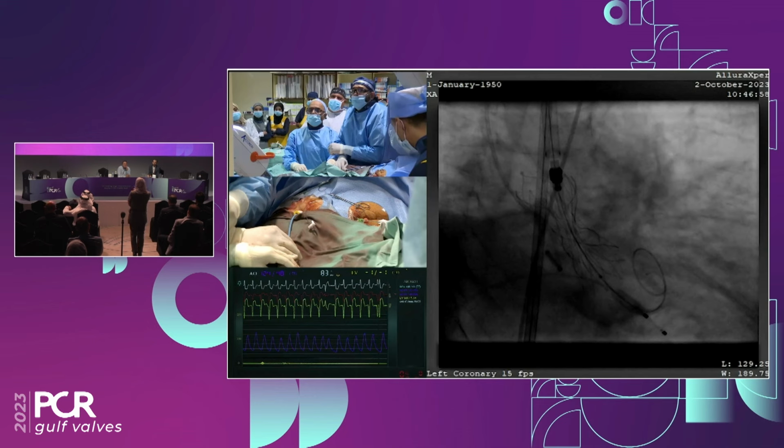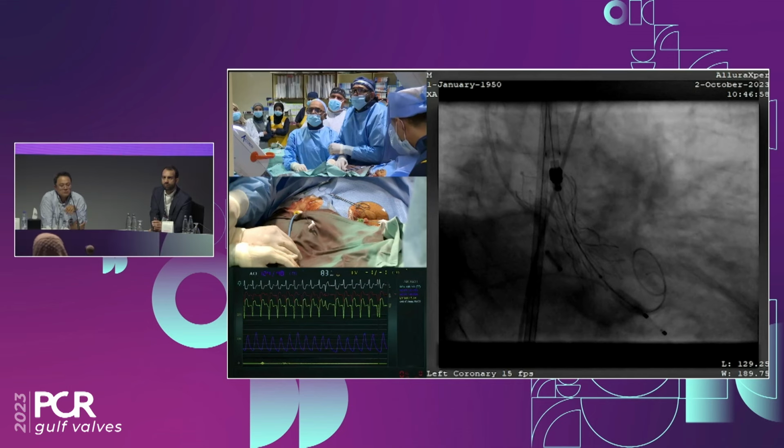What balloon did you size based on your diameters before this? For post-dilatation, we decided from before that if we need to post-dilate, we'll dilate to a 26 balloon. I think in the previous Navitor generation, it was mandatory to pre-dilate and post-dilate. There was a talk that because of the large cell frame, maybe you need some. The perimeter was 85, so you had a large anatomy. So maybe a 22 balloon was a bit small.